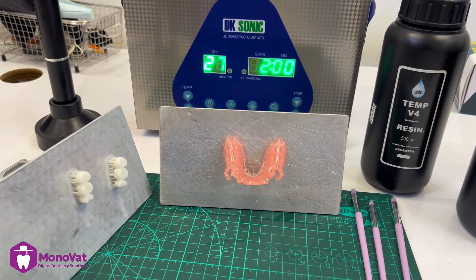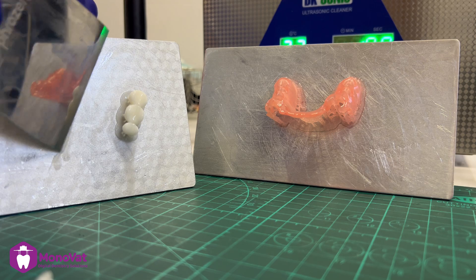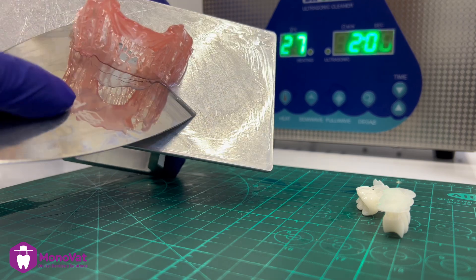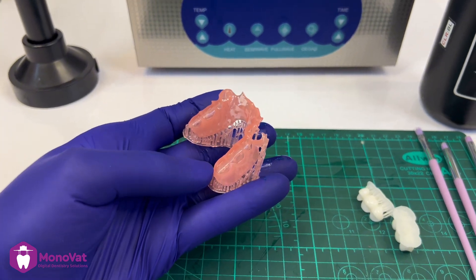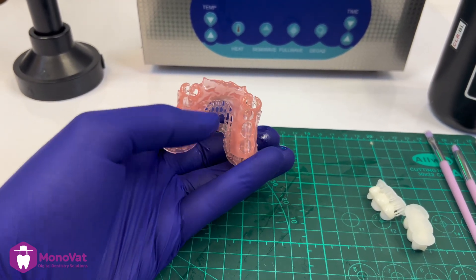The Temporary V4 contains 30% nanoceramic with radiopaque property. I first remove the teeth and the denture from the platform. Here I should say: don't remove the support — we will use it to support the denture during the wash and curing stage.